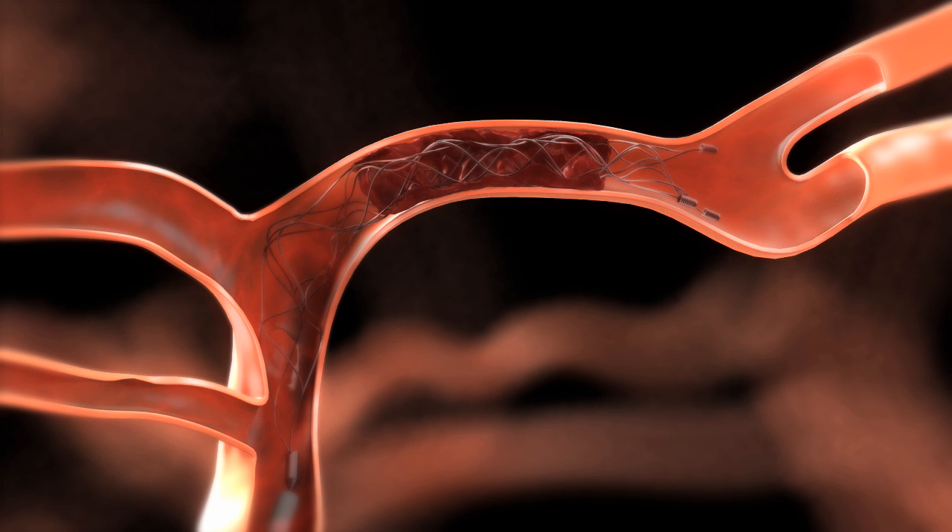Tighten the RHV around the micro catheter, and angiographically assess the revascularization status of the treated vessel.